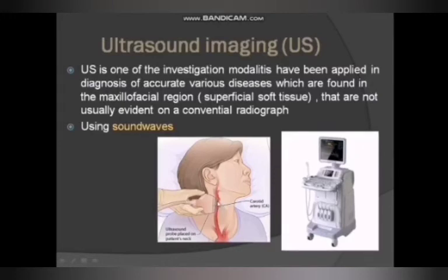Part of it continues to penetrate and is absorbed by air and bone, so no image will result, and part of it is reflected back toward the transducer. The reflected echoes are reconverted into electrical energy, amplified, processed, and displayed on the screen.